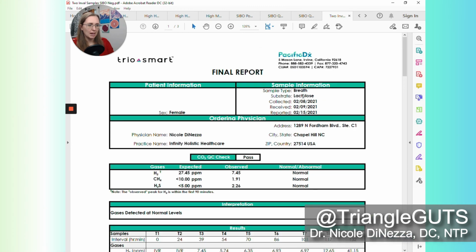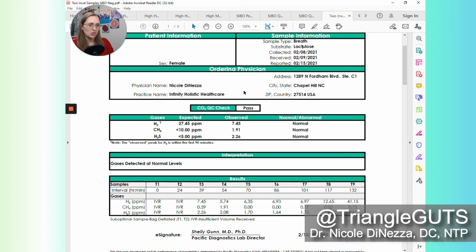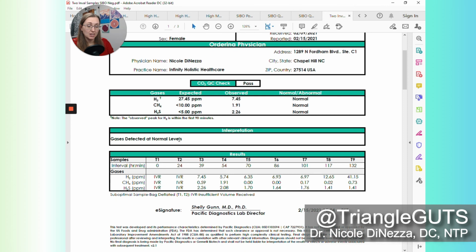So here we have another lactulose test. Again, I see a lot of people with yeast and blood sugar issues, and I'm just so cautious to do glucose with those folks. So I do use lactulose a lot, even though it's less accurate. But you could see, with lactulose we have to keep in mind the whole transit thing. This one says gases detected at normal levels, so that's cool. All right, go you. But also, if you look down here, samples 1 and 2 are invalid. So the person, for whatever reason, did not collect their gases super well for the baseline samples.